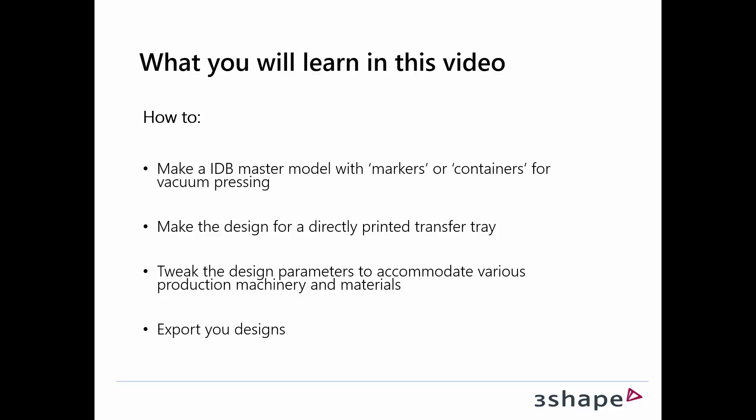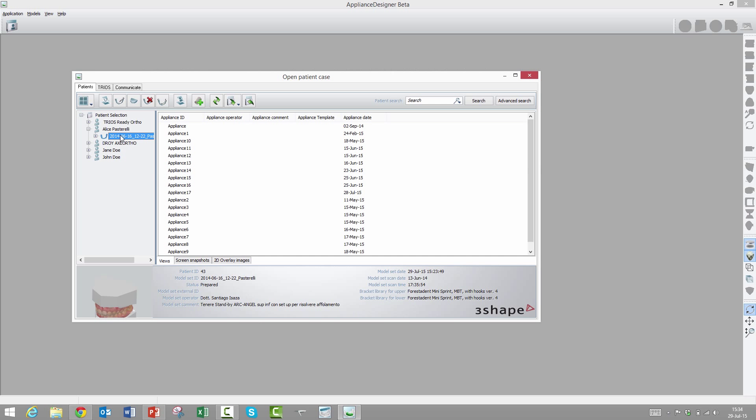Depending on what printer you have and what materials you put on it, our software can support that. Also, to be able to get your designs out in a format that you can actually put into a machine. Let's have a look at how it works.